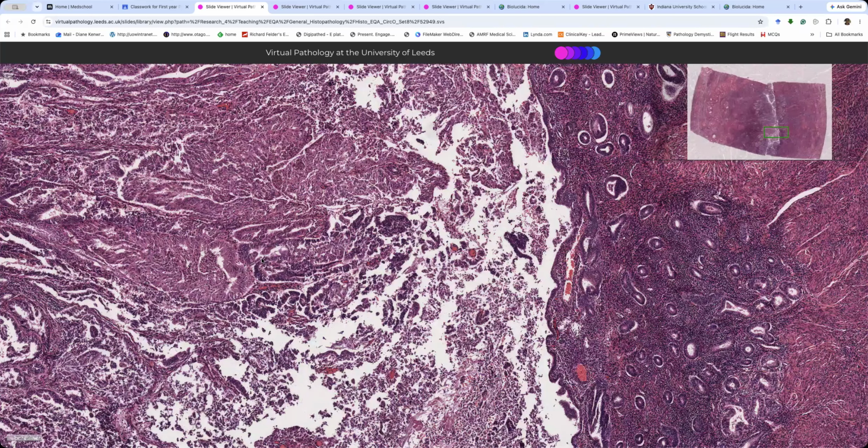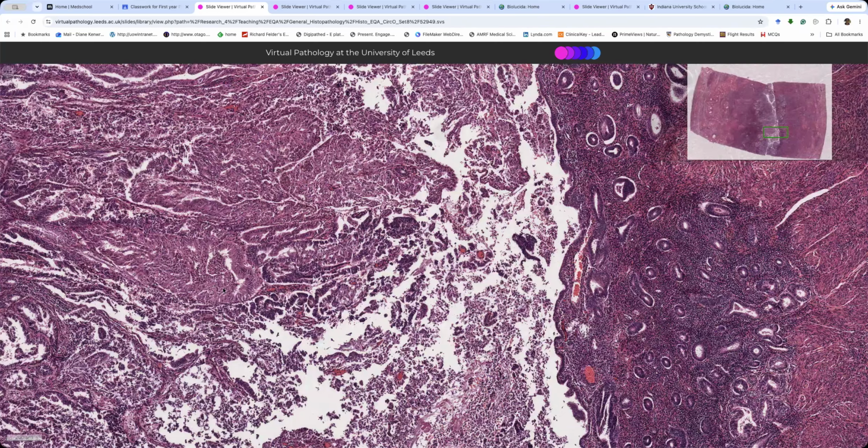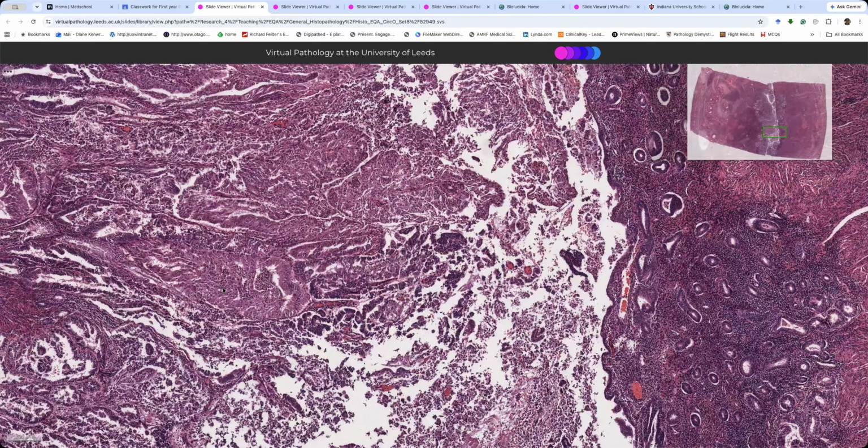Can we tell the difference between grade 1 endometrioid carcinoma and atypical hyperplasia on the cytology? This is a yes/no question. Yeah, Adam, yes, less than 5% solid is grade 1. So it's less than 5, 5 to 50, and then more than 50. And if you're ever going 49 versus 51, I usually go down.